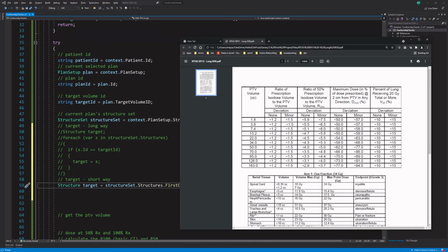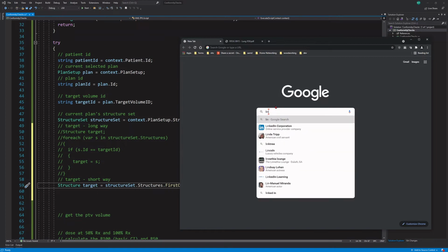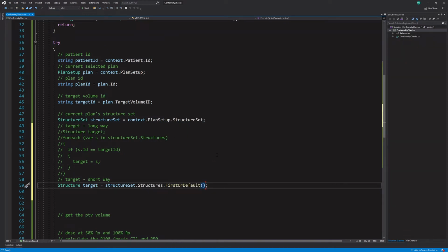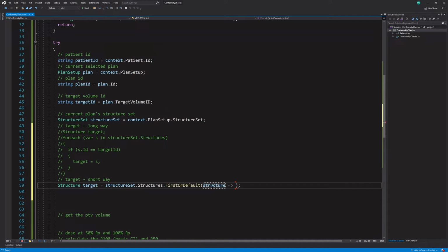LINQ stands for, well, if we hover over it, it should say, actually it doesn't. Let's see. Anyway, LINQ stands for, let's search. L-I-N-Q. LINQ C#. Language Integrated Query. Okay, so it's a query built into the line of code basically. And this is just the syntax that you use. What it's doing is we're declaring an anonymous variable, so each structure. If you wanted to, you could type structure. It's looping through the structure set, grabbing each structure and declaring that as a variable called structure, and then we would insert our test.